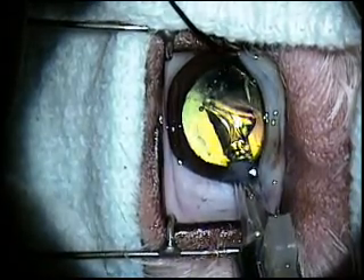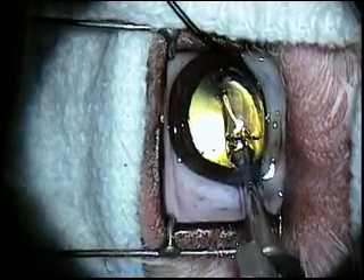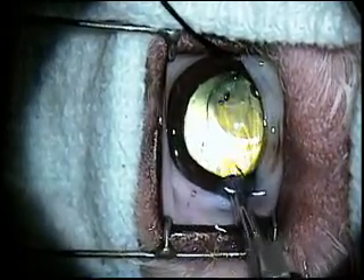The artificial lens is then introduced into the capsule bag and positioned for best vision. The incision is closed and the patient is recovered from anesthesia.